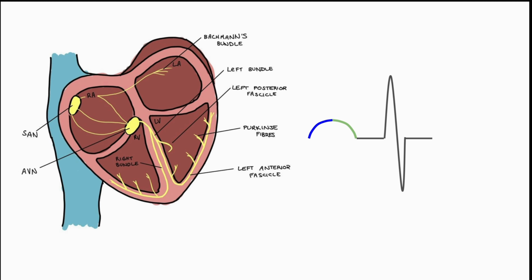consequence of left ventricular hypertrophy, particularly in hypertensive states, what you get is a bifid P wave. That green contribution just coming slightly later now, as it takes a little bit longer for that left atrium to finish depolarizing, meaning you get the first peak from the right atrium, and then that second peak as that green left atrium continues to depolarize. So a large P wave, right atrial hypertrophy, bifid P wave, left atrial hypertrophy.